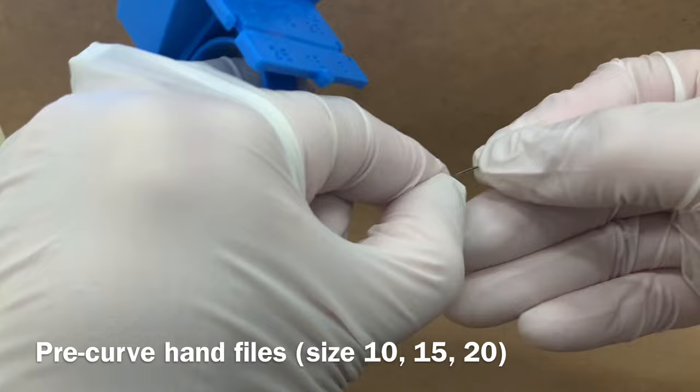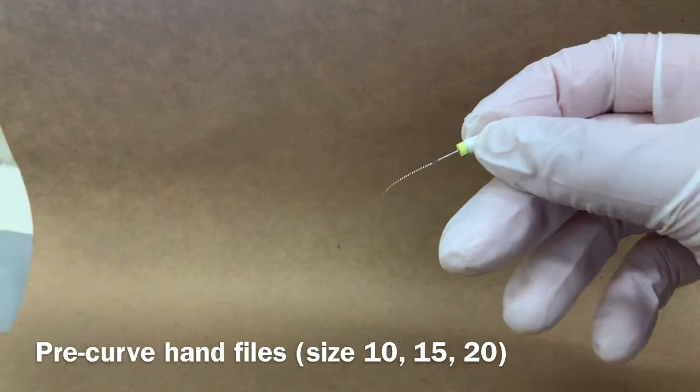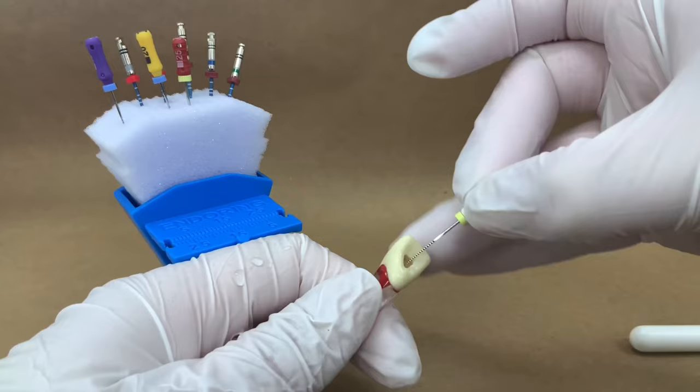A good tip is to gently pre-curve these smaller hand files. Pre-curving the file allows you to negotiate the curvature within the canal and prevent ledge formation and apical transportation.